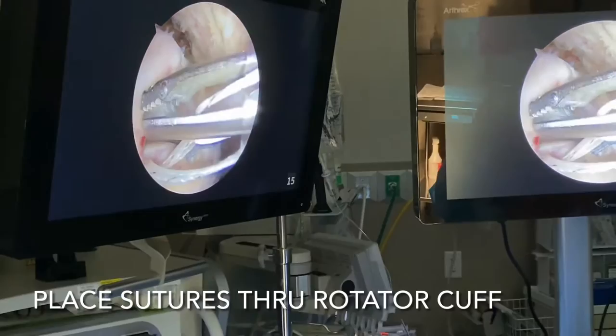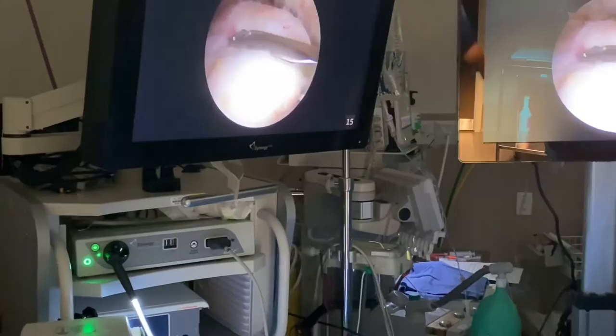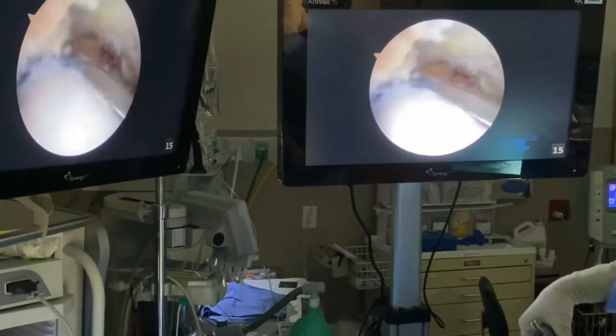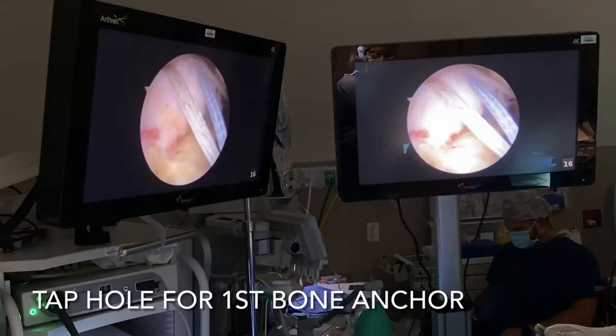I'm going to repair this with a double row anchor. You can see an anchor in the front here and an anchor in the back. I have a stitch loaded on this back one. I'm going to throw my first stitch — I have a scorpion device. I passed that stitch right there with that device. We're going to take a bite here anterior. Our last stitch is right there, so I want mine right around here. Pass the suture there — good. We've got our sutures loaded and oriented.